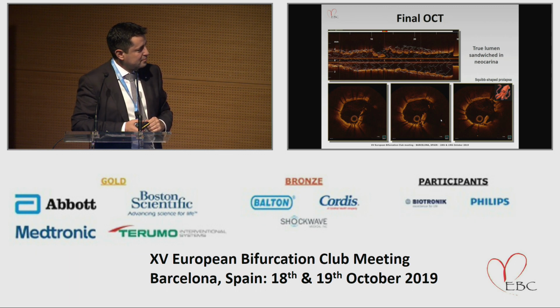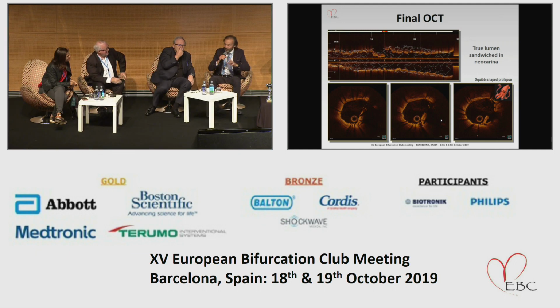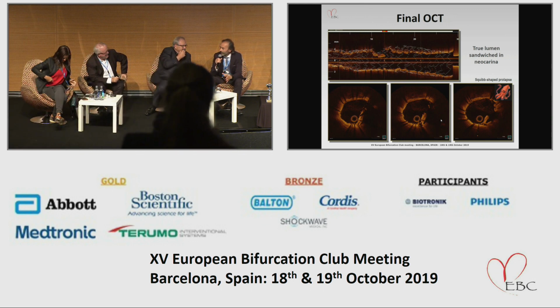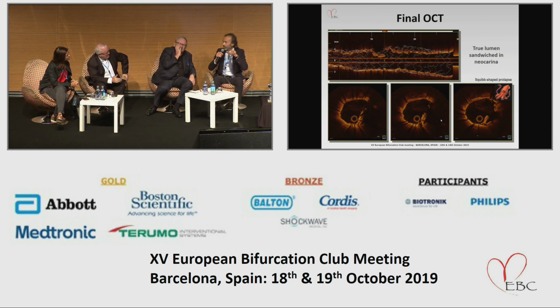Yeah. Thank you. The last comment. The CTO guys, they analyze the CTO and bifurcation. And there is a rule that when you have a bifurcation and you want to re-enter retrogradely, you make the connection not at the bifurcation, but away from the bifurcation. So they usually start antegrade, even if it's retrograde, they go subintimal at the ostium.